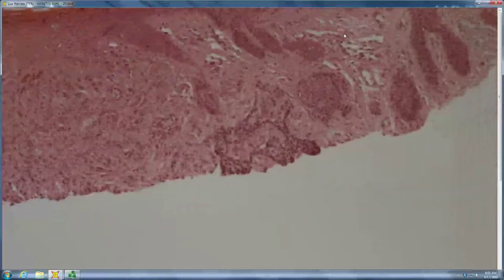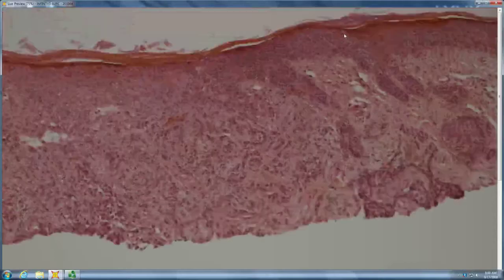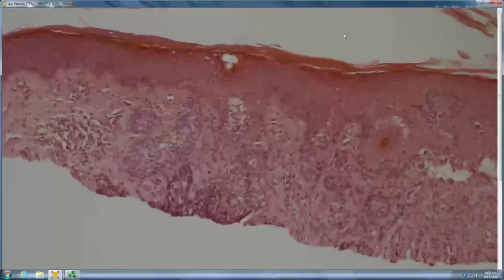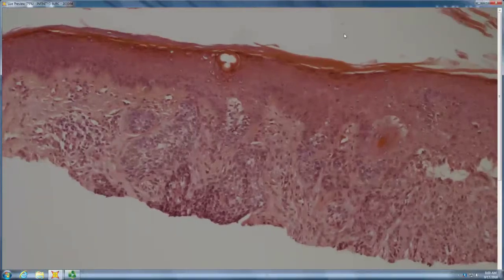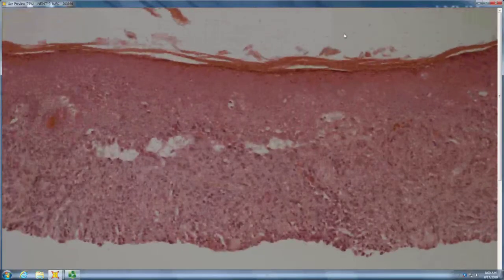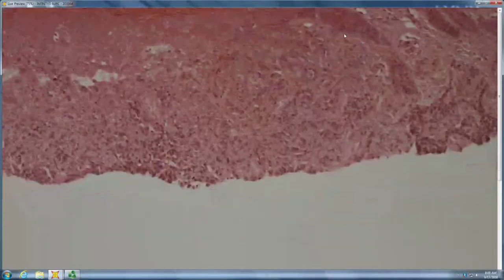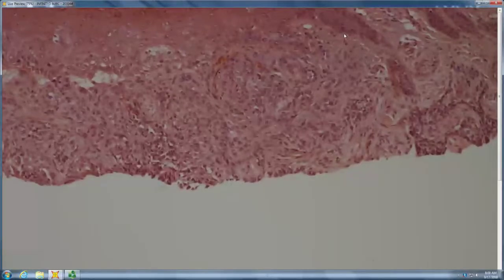What sort of histiocytic in the center? Some of the ends look like infiltrative BCC. Yeah. And if the ends are infiltrative BCC, what's the middle? Infiltrative BCC. Yeah, it is. But it's just where you get that fibroblastic stroma and the little strands of cells, kind of hard to tell what's epithelial and what's not. Often the edges define it better.